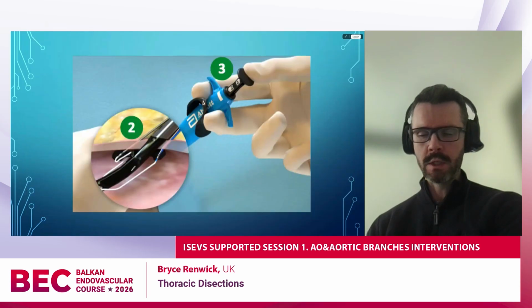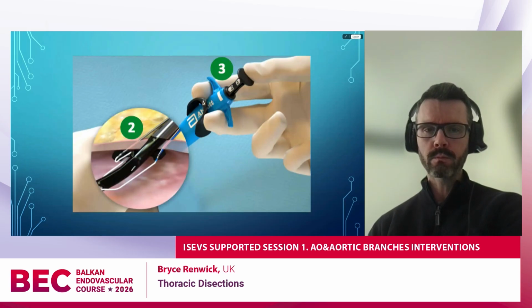And this was all done percutaneously, which is our standard practice, ultrasound-guided puncture and 2 ProGlides, or ProStyles as they're now called. This is all percutaneous from the right groin.